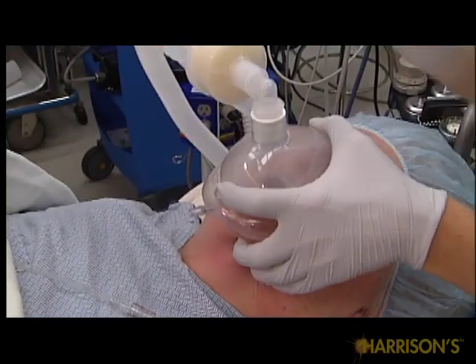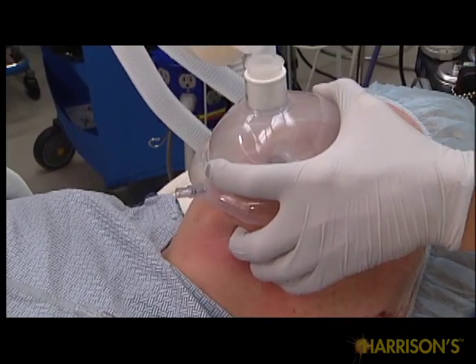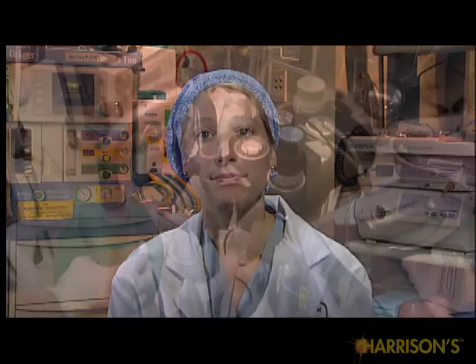Place the fifth finger behind the mandible and use the third to fifth fingers to pull the patient's face up to the mask, rather than pushing the mask down to the patient's face. This technique of lifting the patient's face up to the mask helps elevate the laryngeal structures and soft tissue to create an open passage for oxygen to move from the mouth to the larynx.